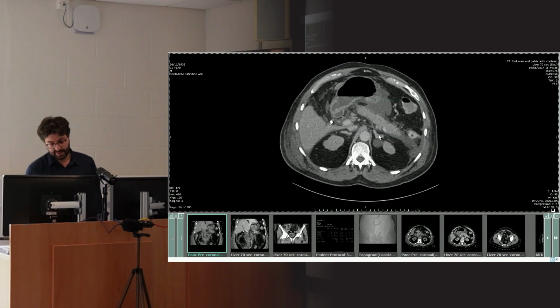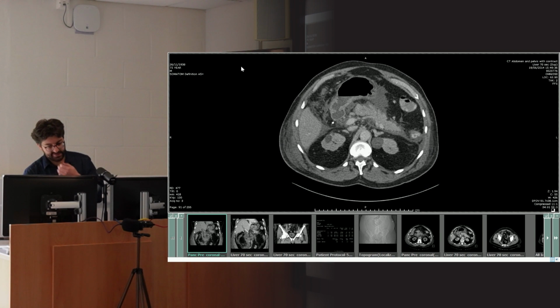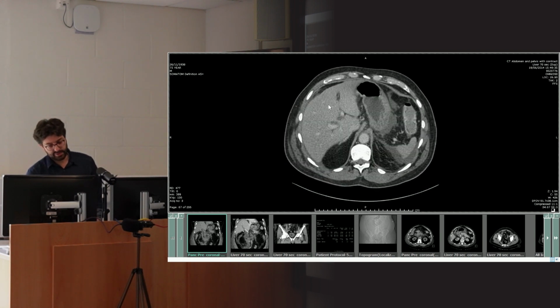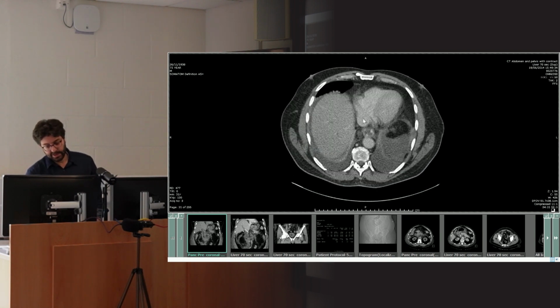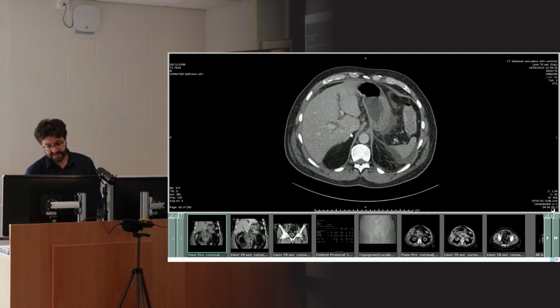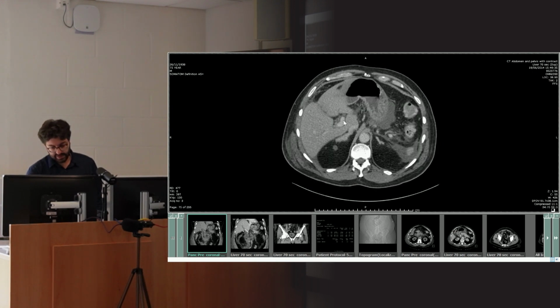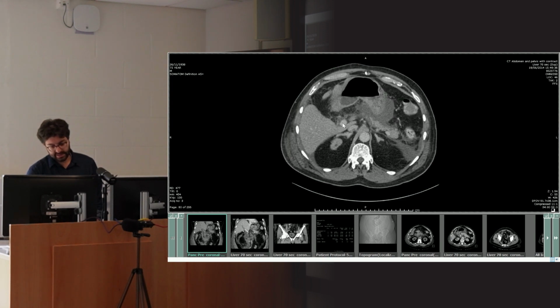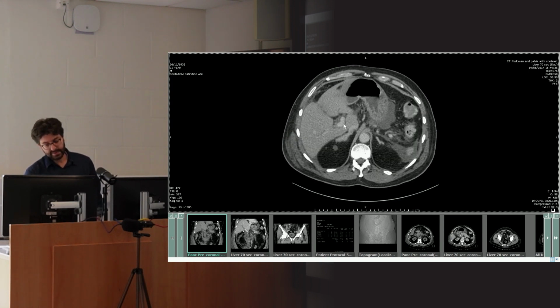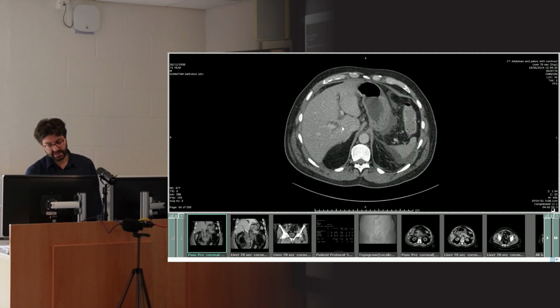The pancreas is a little bit more annoying. And what I always say to people when you're looking for the pancreas is actually follow the portal vein first. So here from the heart, we've got IVC coming down. You've got 3 hepatic veins joining the IVC. IVC then comes around the back here. And then anterior to the IVC, so in front of it, you've got the caudate lobe, which is this bit of the liver. And then in front of that, or just lateral to it, you've got the portal vein. And this is the portal vein here. You can see it splits into left and right portal vein going off into the liver.